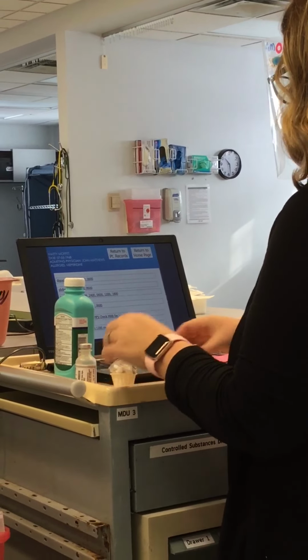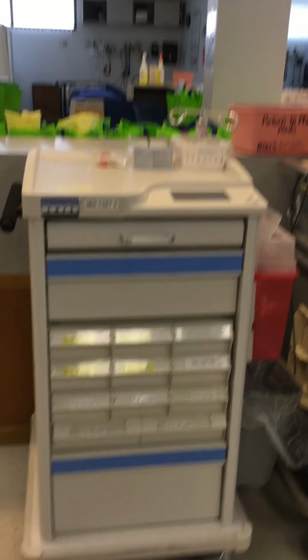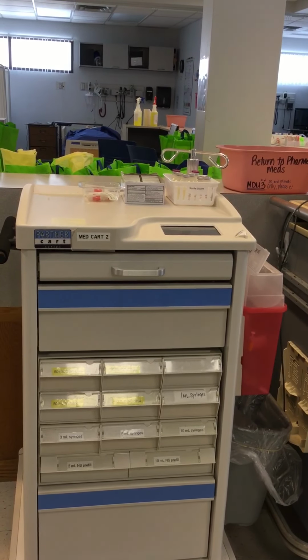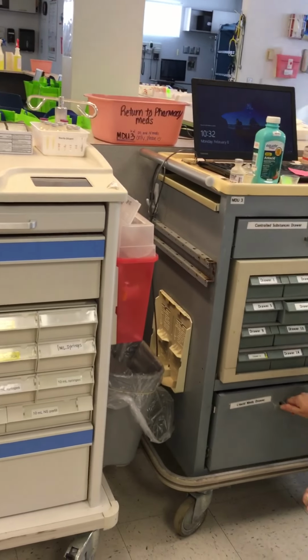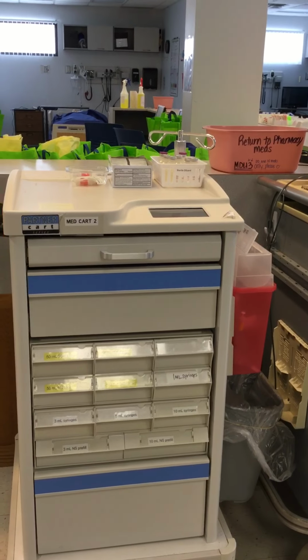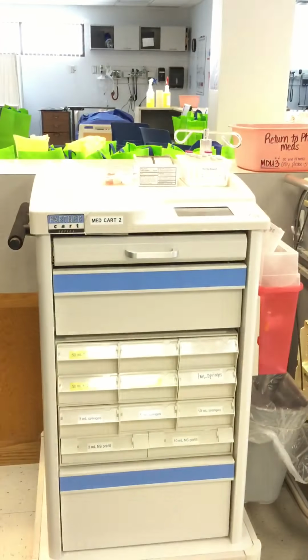I'm going to bring one of these cups with me so I can measure when I get back to the room. I already have a med cup. I'm going to bring some alcohol preps and a syringe label to put on my syringe. And unlock this cart.